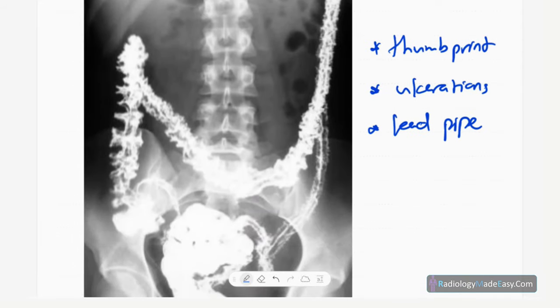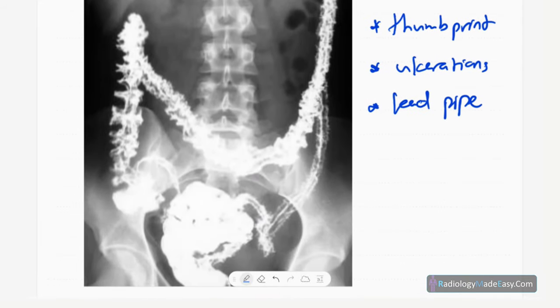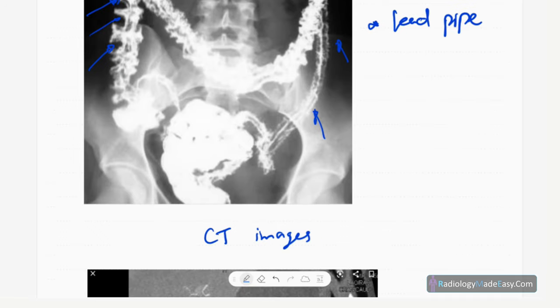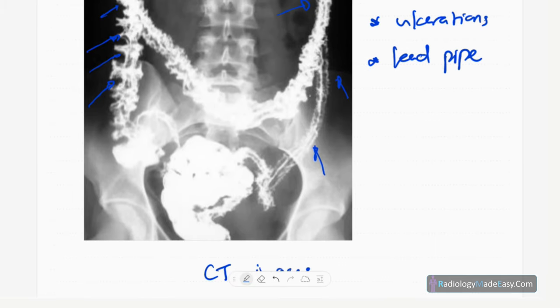Another lower GI contrast study shows loss of the haustra bowel pattern in the descending and transverse colon — lead pipe appearance — along with thumbprint appearance due to thickening of the haustra. Ulceration and irregularity of the bowel loop are also seen. This is another example of ulcerative colitis.